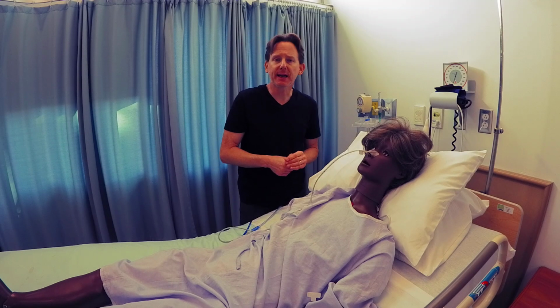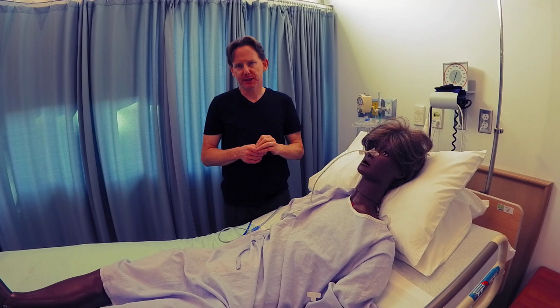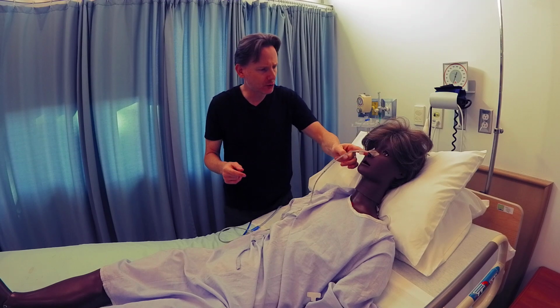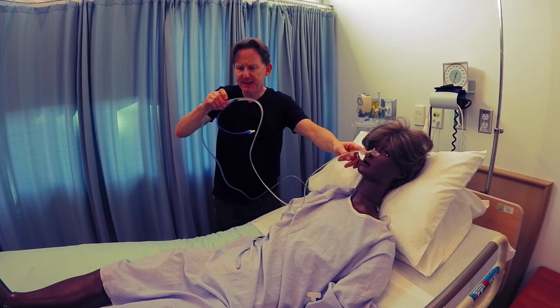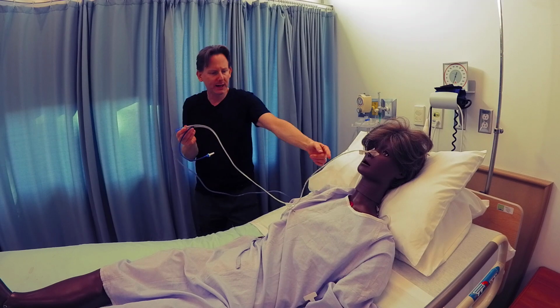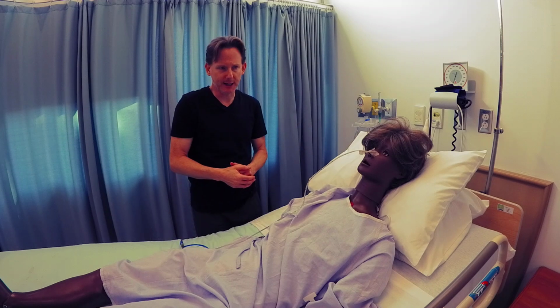And that is why best practice is to also do an external measurement. An external measurement involves taking a piece of plastic tape measure and going from where the tube enters the nose down to where the NG tube meets the suction. So you measure this whole bit here with the tape measure, and you find out what the external length is. And you chart both, internal and external length.